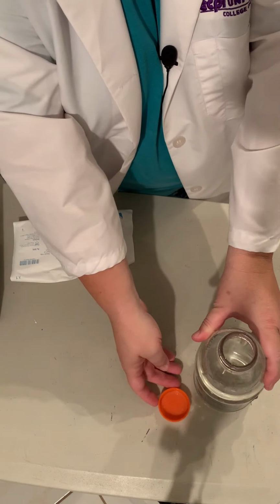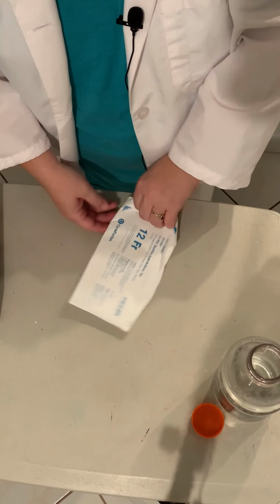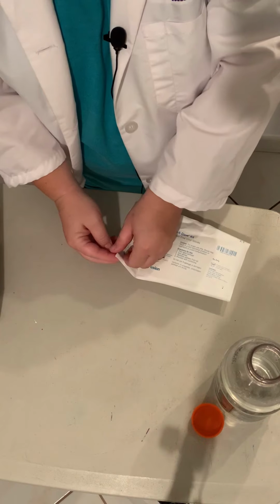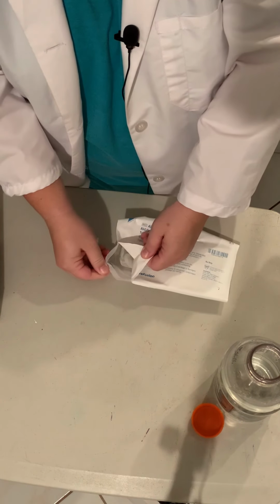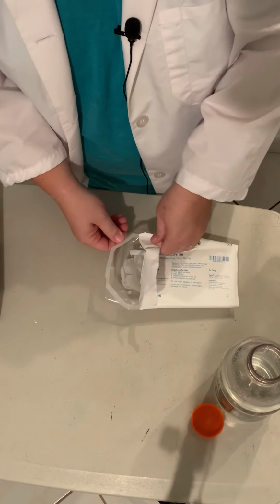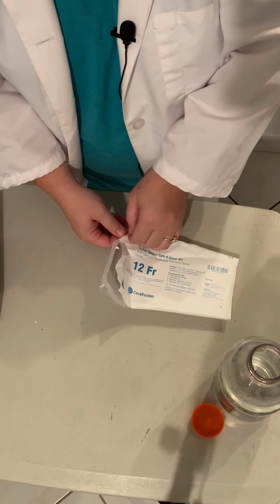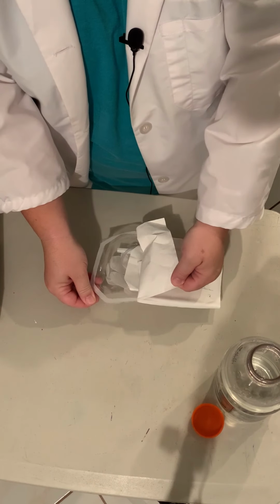And then we're going to push it back out of the way. All right. Then we're going to open up our kit. And we're going to do that kind of slowly and carefully here because sometimes the contents can get jarred around in there.